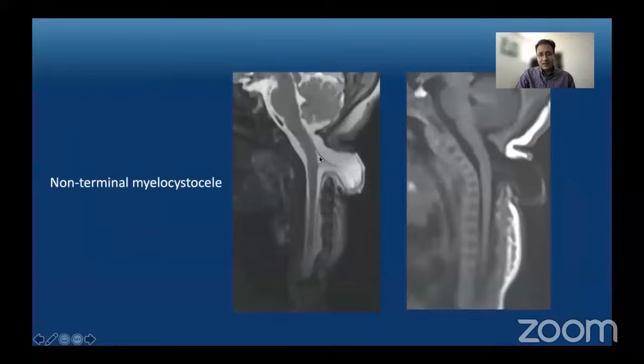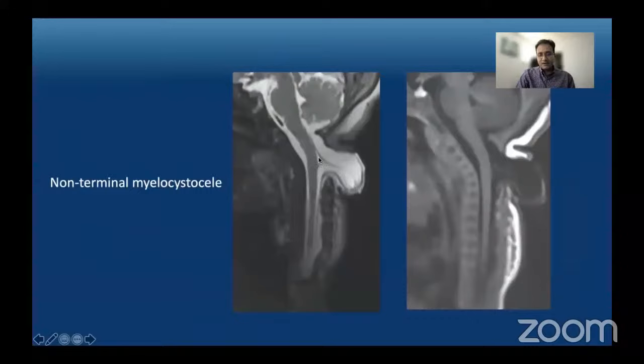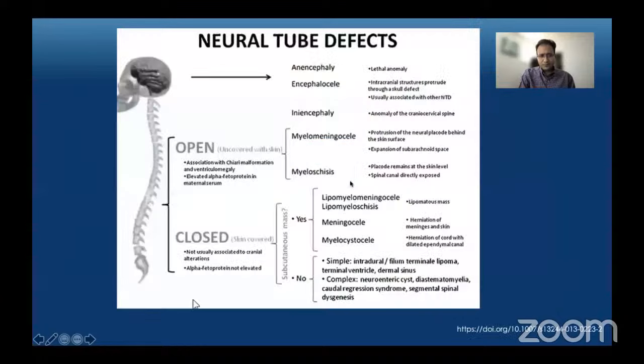This is an example of non-terminal myelocystocele where we have a dilated central canal extending into a fluid-filled tract through a dysraphic defect in the upper cervical spine — this is the meningocele component. It is like a cyst within a cyst: the outer cyst is the meningocele and the inner cystic component contiguous with the spinal cord is the myelocystocele component.